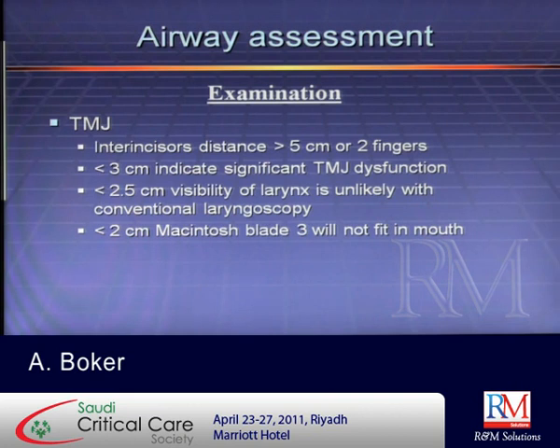Out. Raise your hand. In. Fast track. A rigid LMA. Fast track. That's a tricky question.